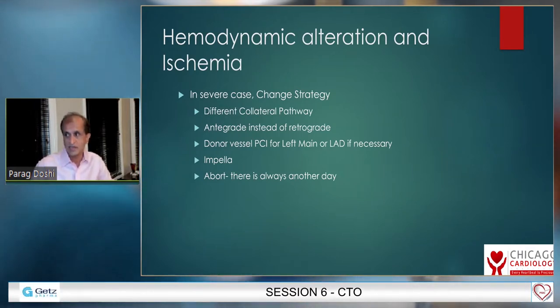Impella is priceless if it's available and you have to plan for it. And the worst case scenario, abort the case, there's always another day. Always, you can plan better. Sometimes you can put the patient on ECMO or even call for general anesthesia for the lesion.